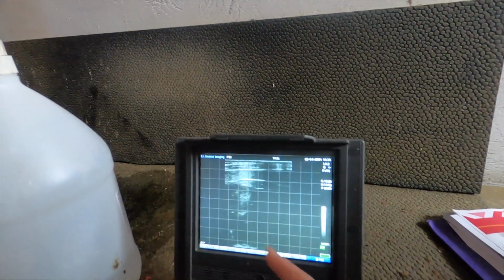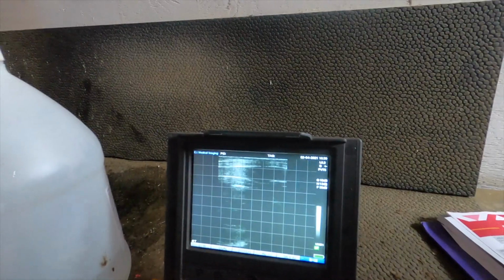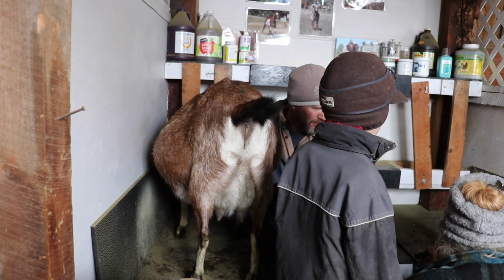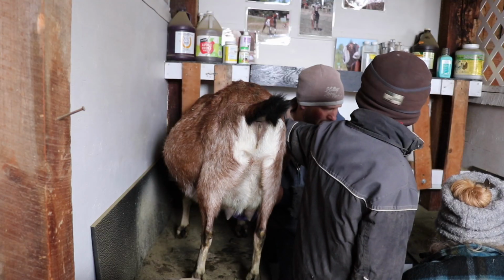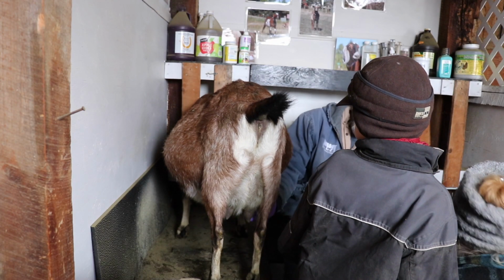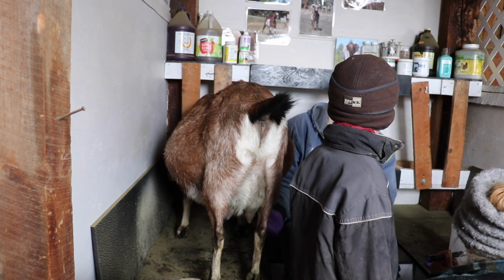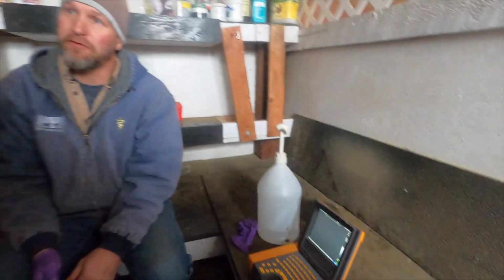There's a hole right in the middle of where that kid is. Yes, right there, that's okay. Exactly, that's the rumen in that kid. We're not going to do very good on numbers today. We'd have to really shave them. So there's 2 for sure. I bet you could even sex these things. Like I said, you'd have to shave a whole swath here. And at this point in the year, it's a little chilly for that.